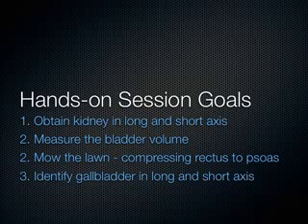I think it has an effect on the psoas muscle, brings the psoas muscle maybe a little bit more anteriorly. That's one of the things I can think. It does something too with the lateral abdominal wall muscles maybe too, brings those in a little bit tighter so you can use them for compressibility. Brings the contents of the abdominal cavity, the intestines, a little bit more anterior, so you're compressing anteriorly and not laterally coming from the side. That's the only thing I can think of. I get that question all the time, and that's how I think of it. It just brings everything a little bit more together, a little tighter into the abdominal compartment.